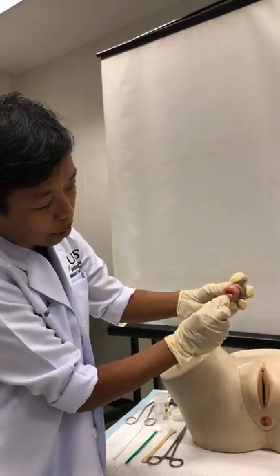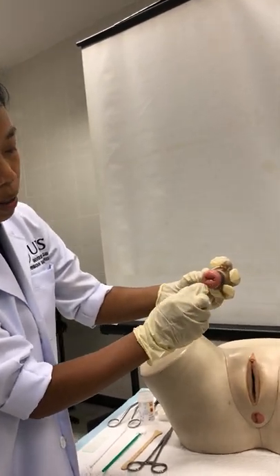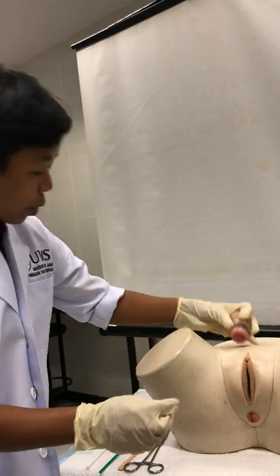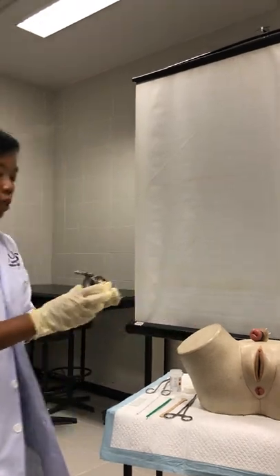This is a small mannequin representing the cervix. This is a normal cervix — if you see it, there will be a slit opening. There is no growth on it. When you see the cervix it should be pink in color, or it can be a little red, but there must be no growth.